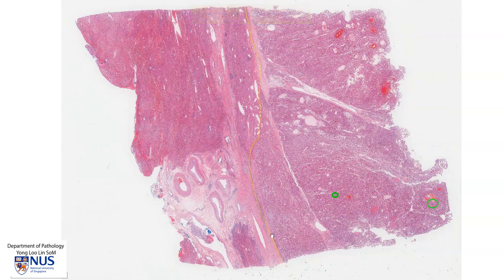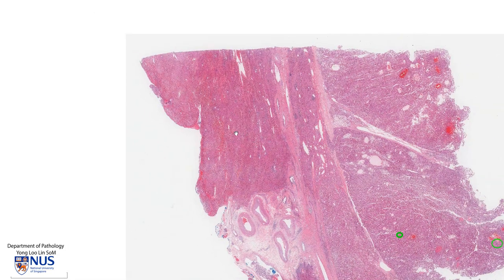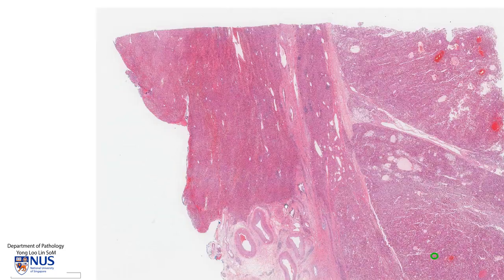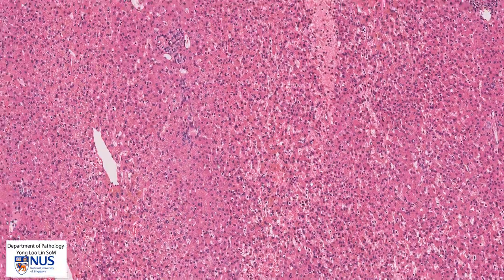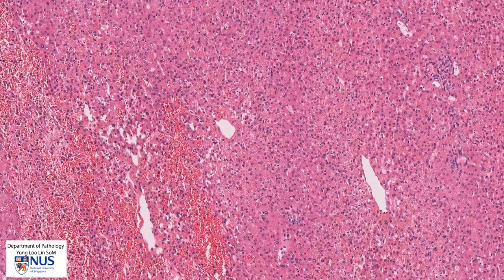The outline of the tumor is roughly here, following my pointer to this area. Let's have a very quick recap of normal liver parenchyma. These are some big blood vessels as well as a large bile duct here. In this benign area, we can see that there is actually a lot of hemorrhage and congestion, probably secondary to surgical manipulation.